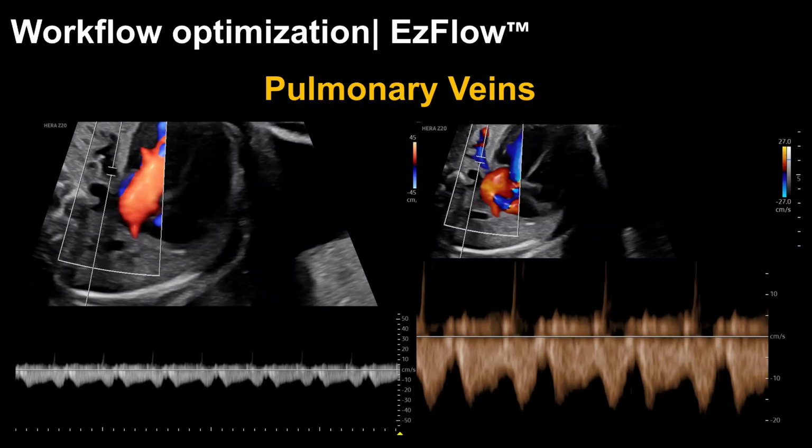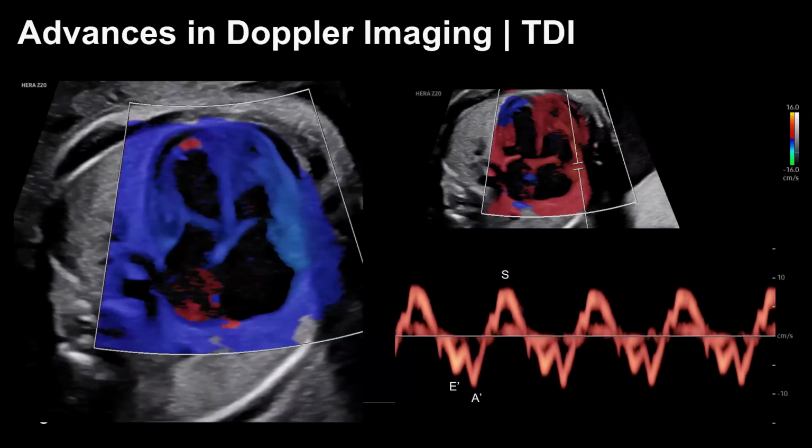And for those who do a lot of exams on twins, in particular if they are monochorionic twins, this is also a very helpful tool because it helps you to catch a certain position of the baby, get the clinical information and move on to the next day.